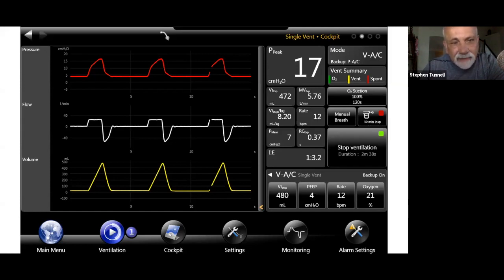And so what is of interest is that if you get a flow measuring device and measure the precision of the devices that we're looking at, you'll find that there is a variance. PEEP baselines do waver; they're not as perfectly on that baseline as you would think. The ability for the ventilator to achieve its peak is usually represented. I don't know of any ventilators that don't represent that, but it may not be as smooth of a transition. There are a lot of smoothing algorithms.